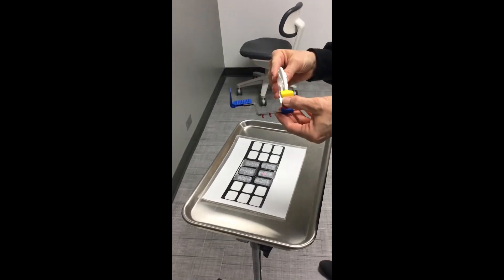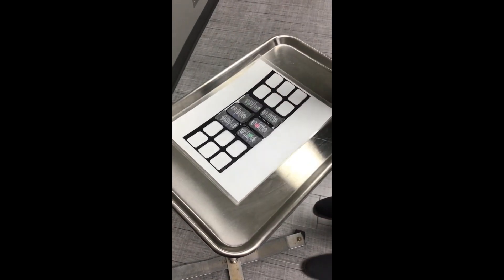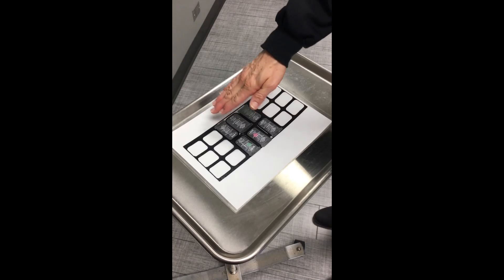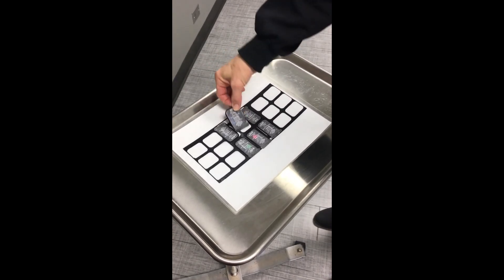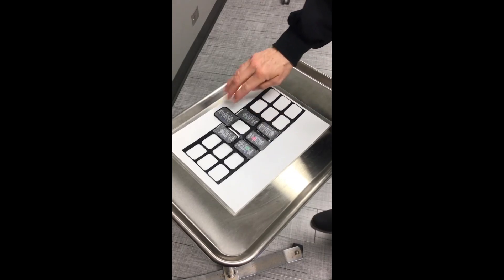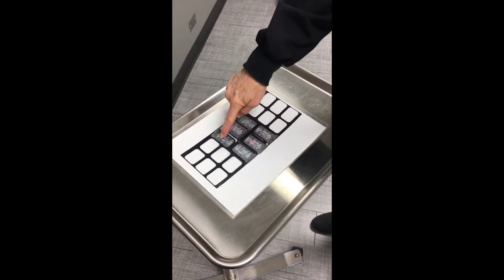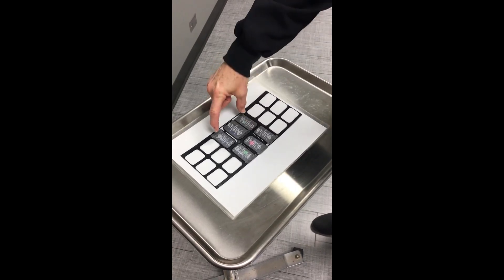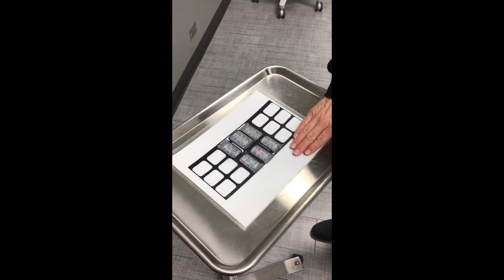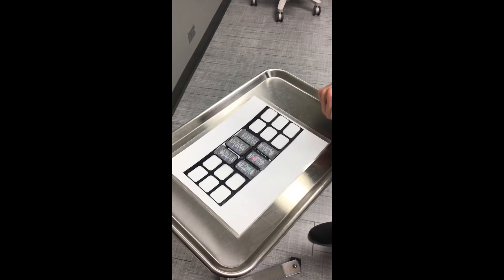Once you have your XCP put together correctly, choose the PSP plate you're going to use. We're going to demonstrate the maxillary central projection first. Looking at our anterior projections, there are six. The maxillary central is the only one that uses a size two sensor; all the others use a size one. These are our central maxillary and mandibular projections, and these are our lateral canine projections. We highly suggest using your sequence sheet to help keep you organized so you'll know what projections you've taken and which ones you still need to take.